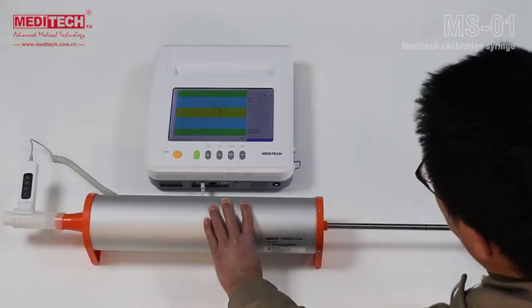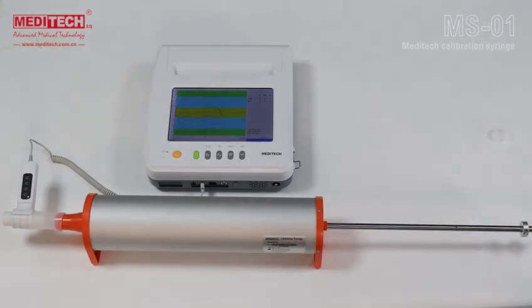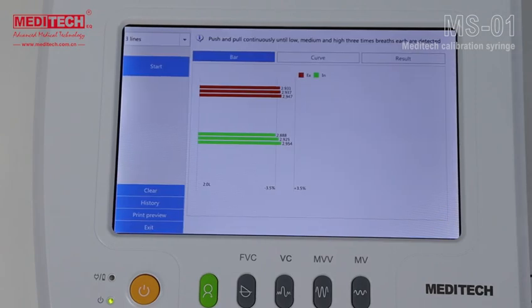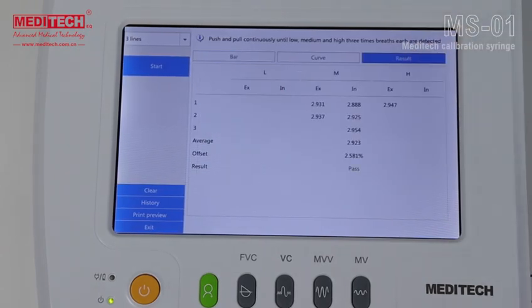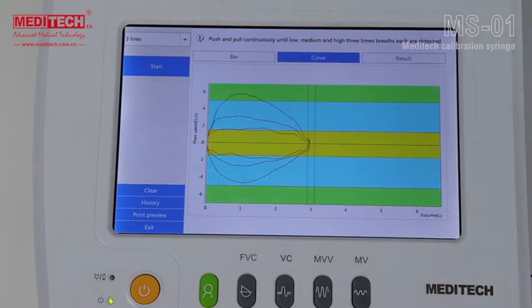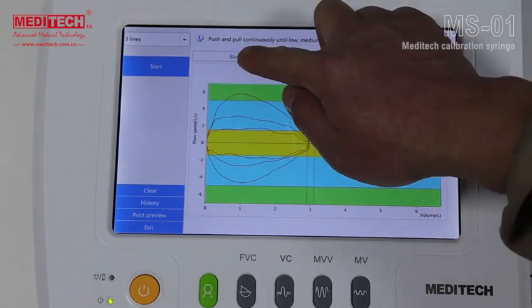Once the test is complete, pull the handle to the maximum position. Two to three seconds later, the test results will be displayed. If the result shows Pass, click Finish and save the data. If the test result shows Fail, click Start to repeat the calibration.